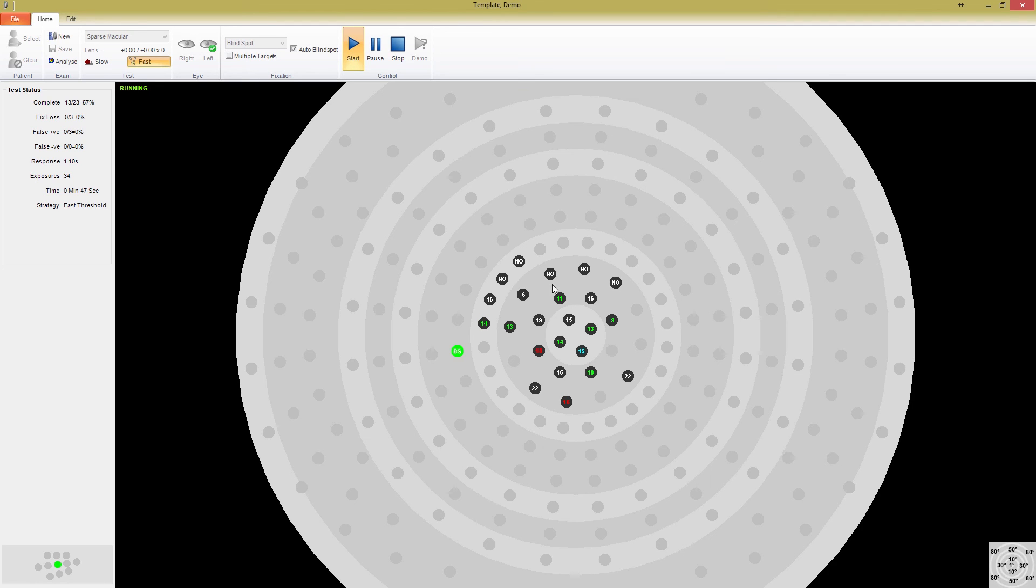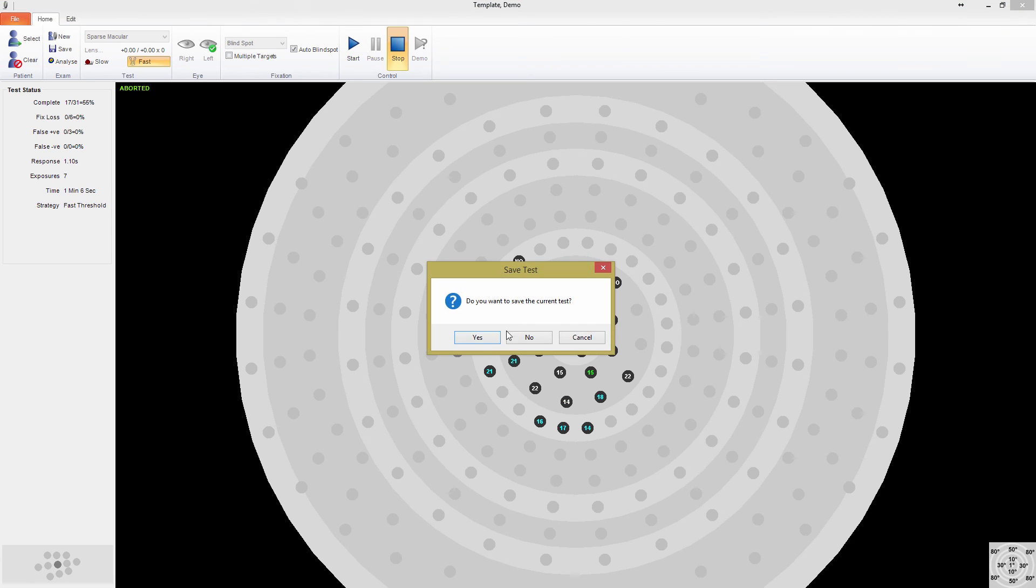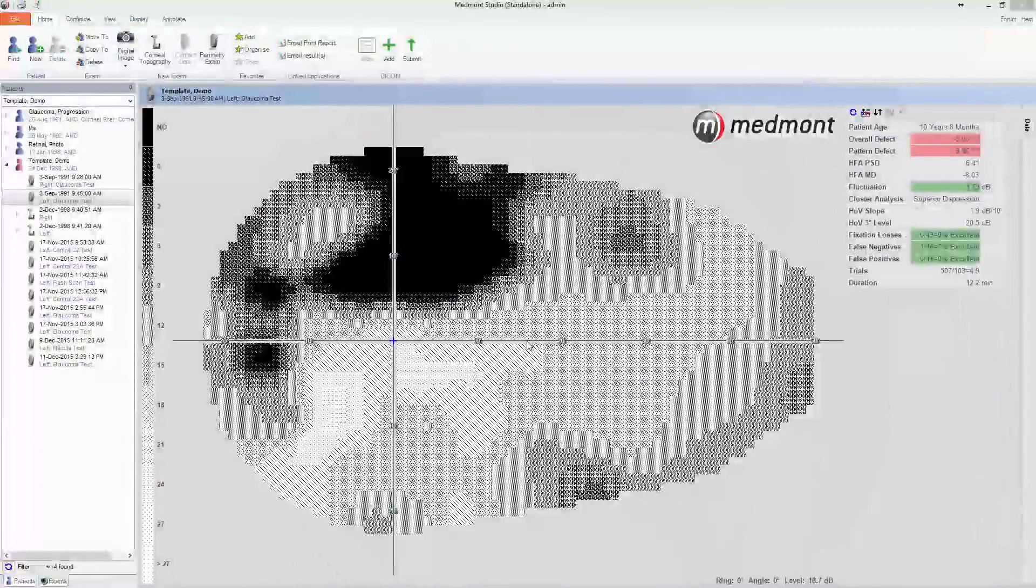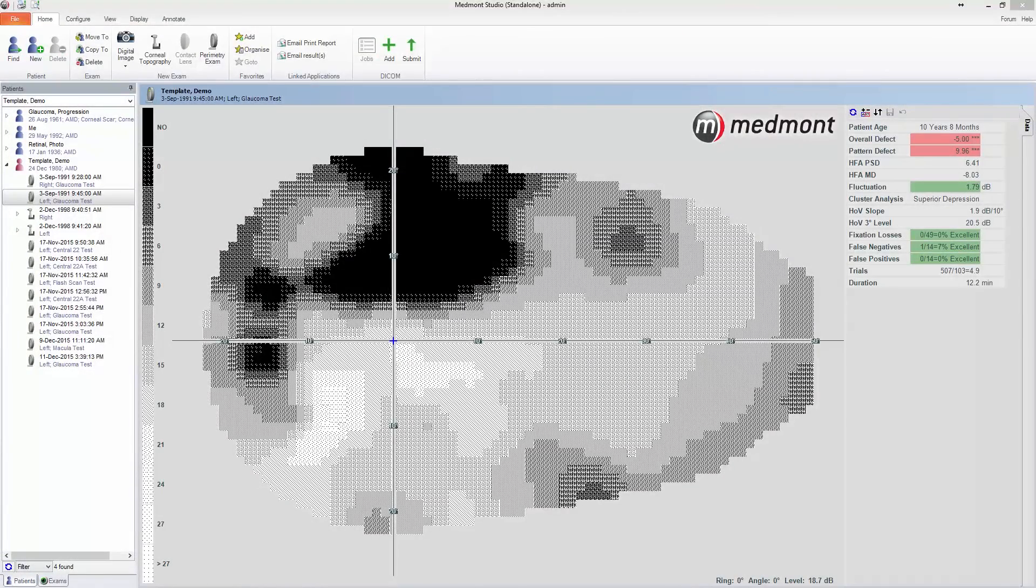To finish this demo off, I'd like to close down the test simulator. We're going to go to the Configure tab, and you'll see there is a Template Setup option in the M700 panel.